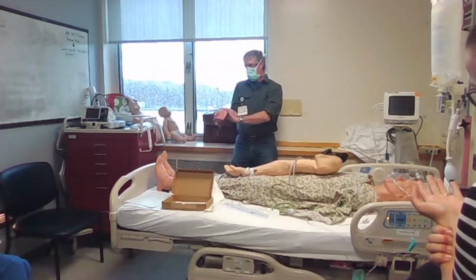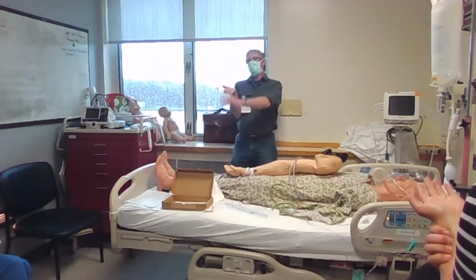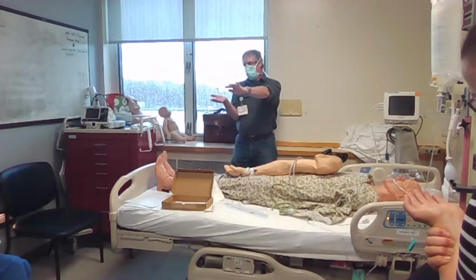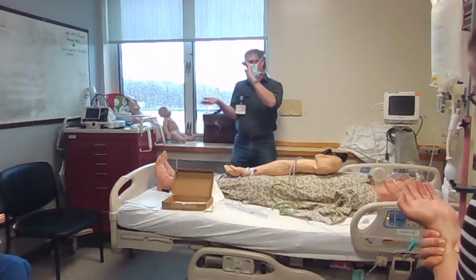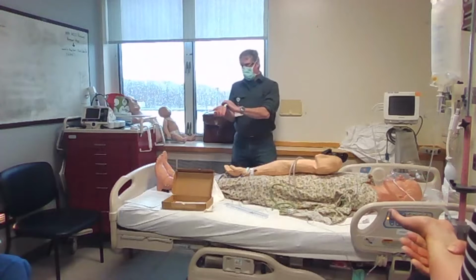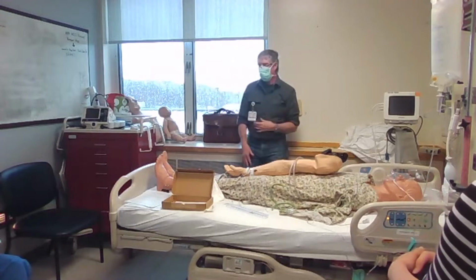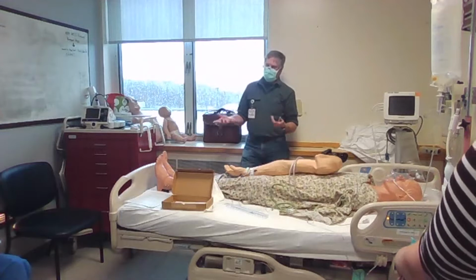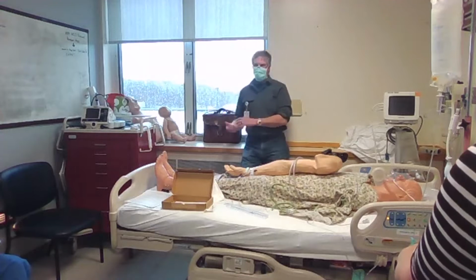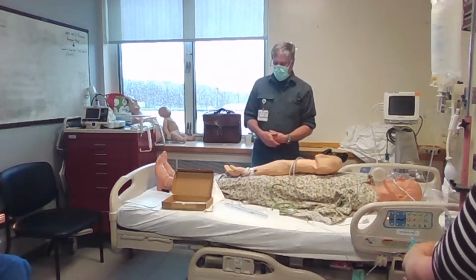So you release the radial side, the hand gets red again. You close the radial side, the hand gets pale again. You open the ulnar side, the hand doesn't get red again. It means you've got insufficient flow on the side of the ulna. So if you lose the radial artery, then you could potentially lose blood flow to the hand. That's the idea behind it, but I think it's really, really hard to lose. The ulnar is 80% of the blood flow to the hand, so you're automatically in a safer position to do the radial artery. That's why most anesthesia providers don't do it.